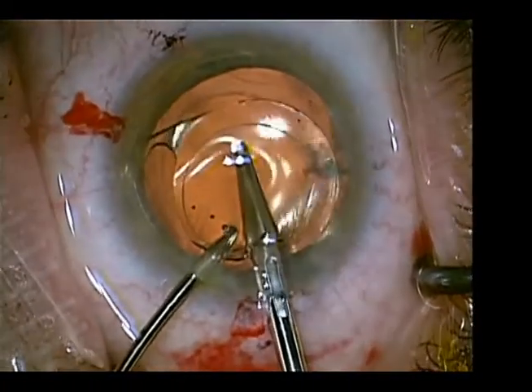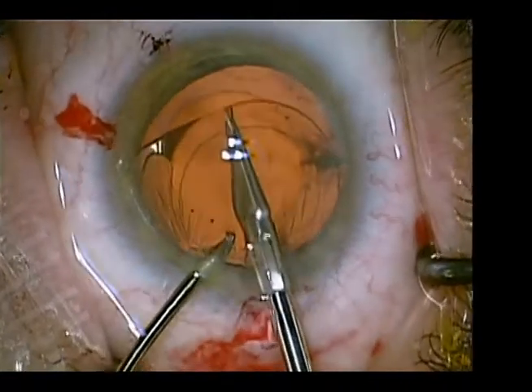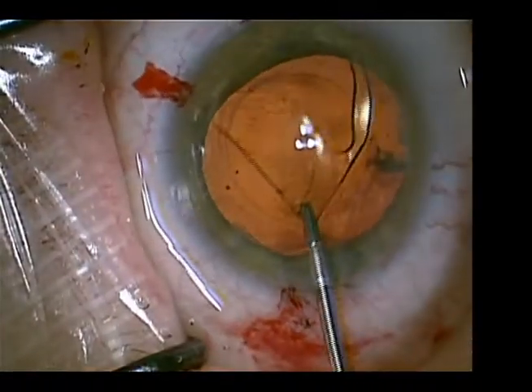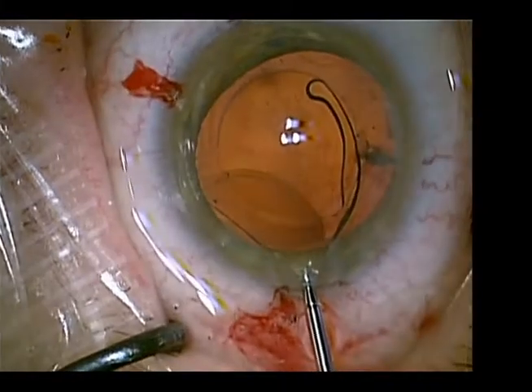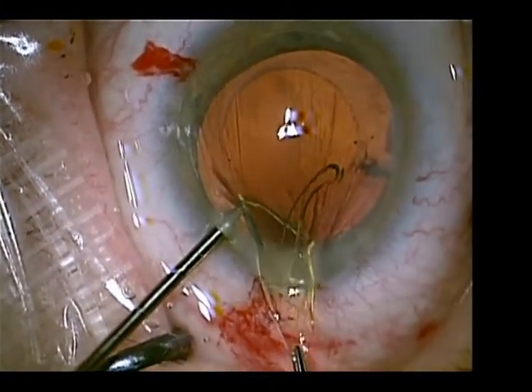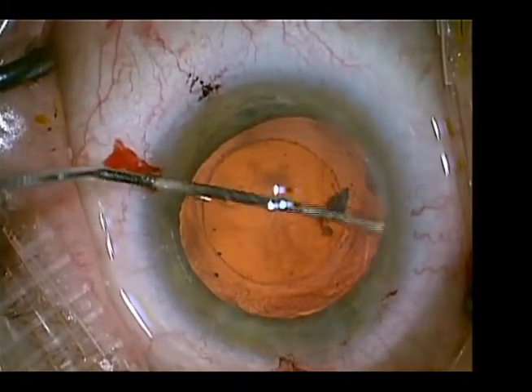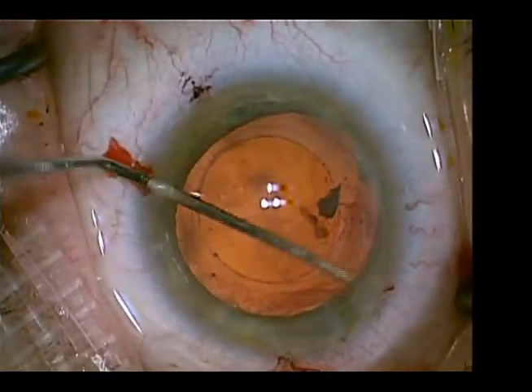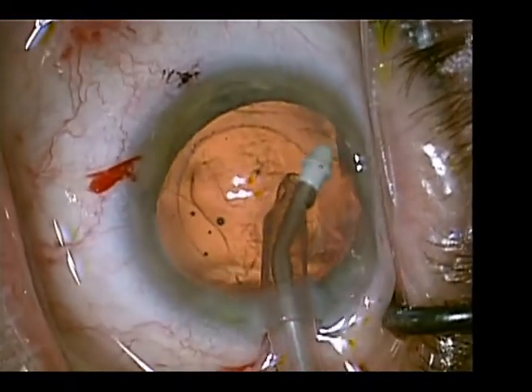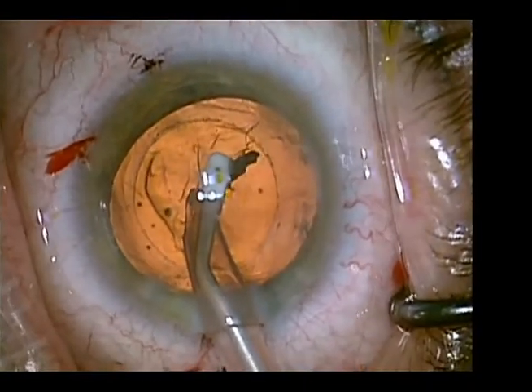Working through the 2.2 incision, an MST micro forceps and scissor are used to transect the lens, which is then removed through the 2.2 incision.